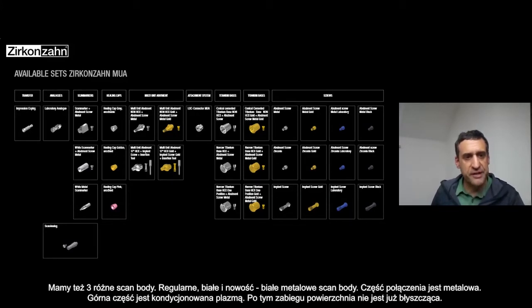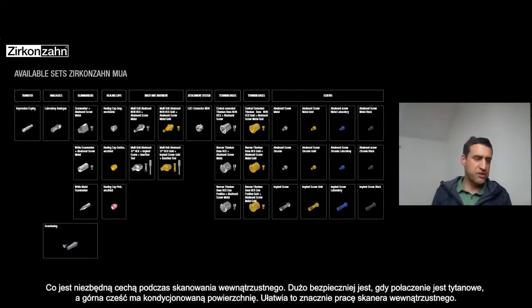Then you have three different scan bodies: the regular one, the white one, and something new that I like a lot — the white metal scan body. The white metal scan body has a metal connection — it's one complete piece. The upper part is plasma treated so the surface is not shiny and is really nice to scan with the intraoral scanner.